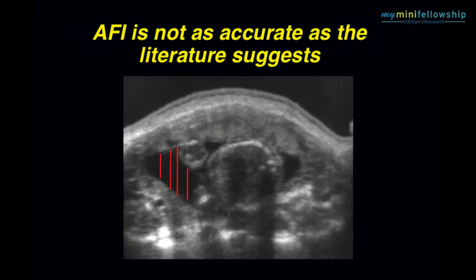But I absolutely assure you that these measurements will be done by differing sonographers at any one of those 4 points. So those are significant judgmental errors in measurement. But in this case, no measurement is really necessary. This is normal fluid. Torso fills the cavity, communicating pockets between the small parts. That's normal.